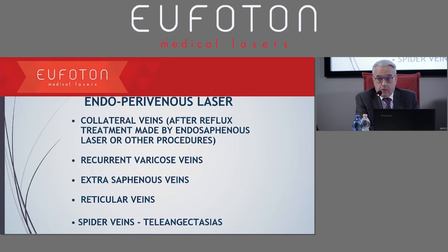In this case, with telangiectasias or reticular or collateral veins, what is fundamental is the initial study with the echo color Doppler of the lower limb. Otherwise, we will have a failure. We must keep into account what happened 15 or 20 years ago when we started treating these issues with the transdermal method.